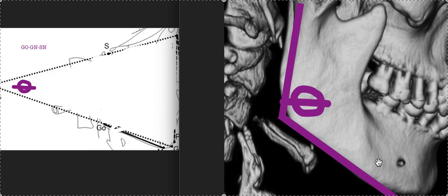But what they were talking about - gonial angle is this, mandibular plane angle is normally defined, and this is the measurement I use: GOGN-SN. This isn't exactly mandibular plane angle, but it's close enough.